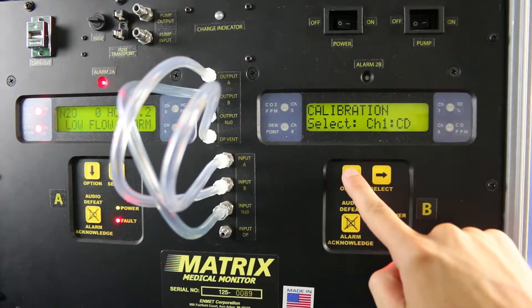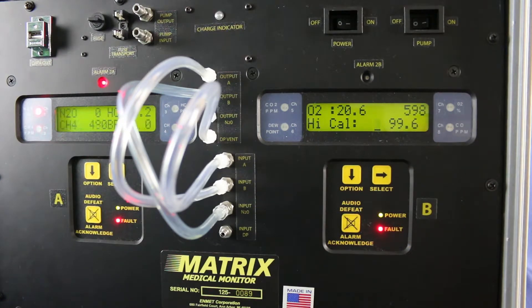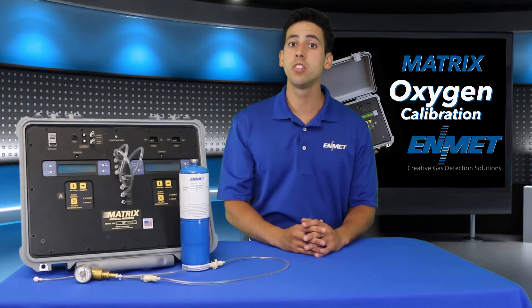Cycle through the channels using the option key until the oxygen channel is displayed. Press the select key to enter the calibration mode for the oxygen channel.